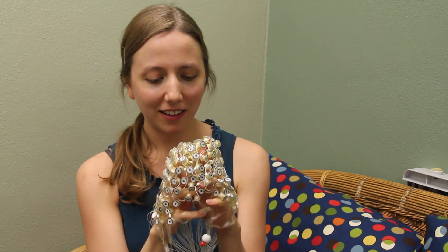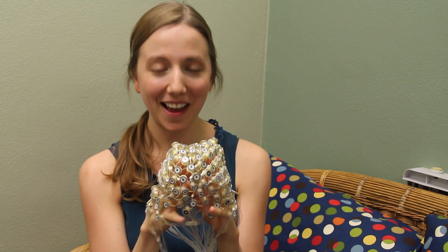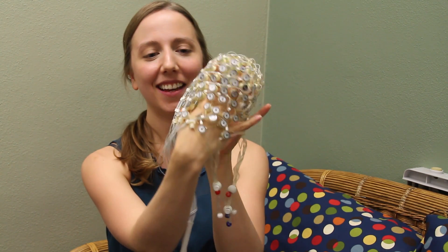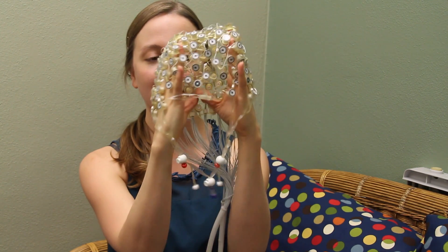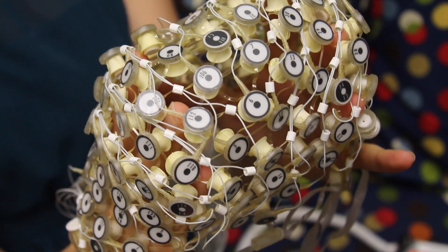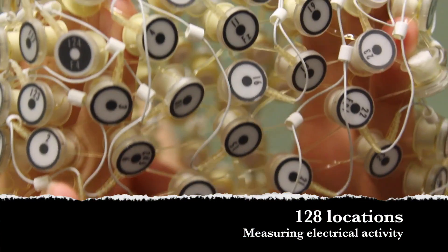You wear the net over your head like a swim cap, and it looks pretty silly. This one is sized for a preschooler. My pinkies are out where your eyes would be, my thumbs are at the back of the head, and there's a little hole for your ear on the side. It comes down so that the sensors cover all the different places on your scalp — we're able to use those sensors to record 128 different locations of electrical activity in your brain.